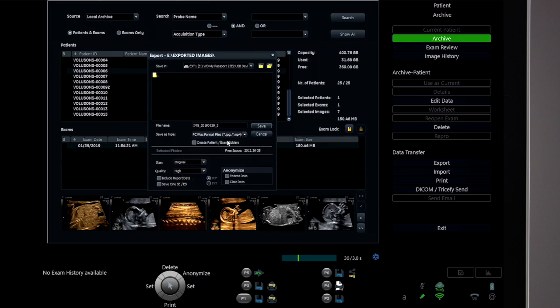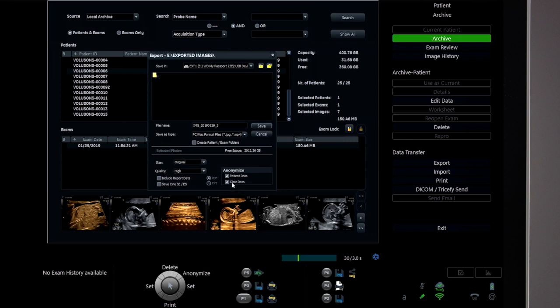Choosing PC/Mac will result in all still images exporting as JPEGs, and all multi-frame clips will be exported as MP4 files. Computer formatted images and clips can also be anonymized, which removes the patient identifiers and clinic name. Studies can also be exported in raw data or Voluson formats.